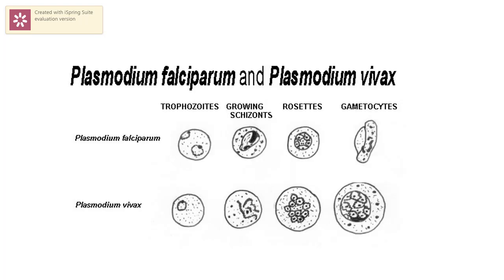As you have already observed the malaria parasite under the microscope, after the completion of the microscopic study, you need to draw the diagrams of different stages. So here in this slide, you can observe the drawings of different parasites, which are based on your observation.